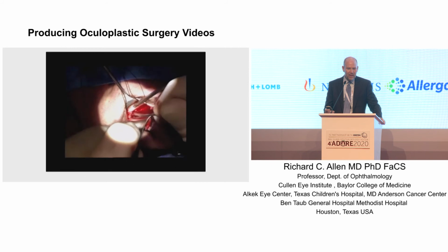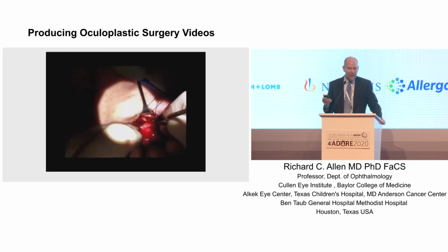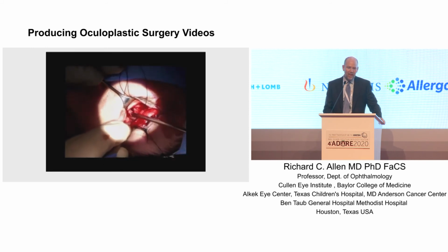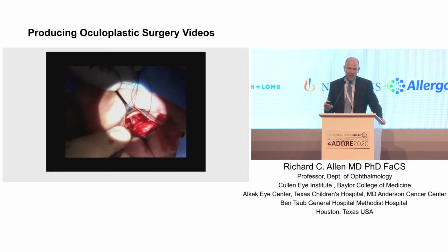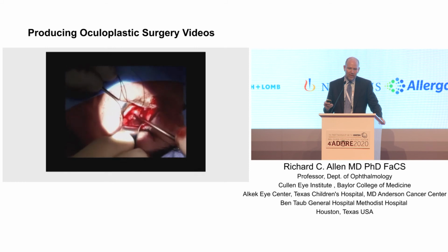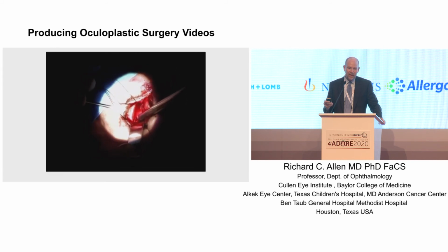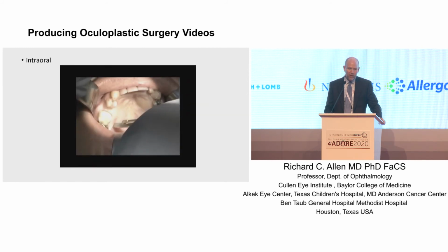And so now I'm doing the same surgery with the camera on my head, upside down, surgeon's view, and so getting down to the orbital floor, and we can see a little bit better into the orbit with this headlight mounted camera where it is coaxial or in line with the light. So I know that wherever I put my light, basically I'm going to be able to get a video of that. So it's nice in the sense that this way I can show depth a little better. So this is just repair of an orbital floor fracture.